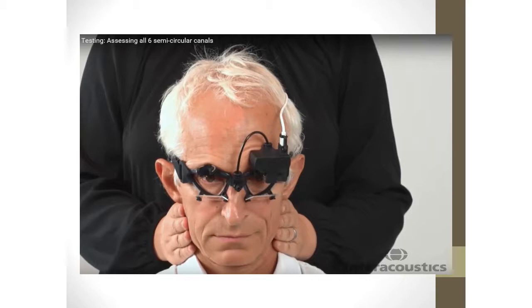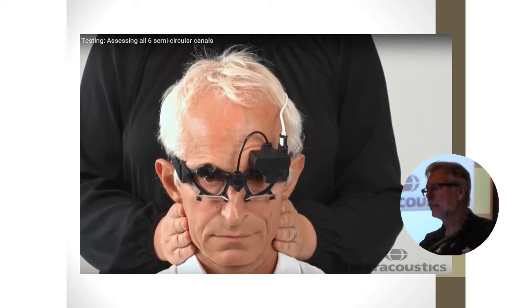And head movement is done by the clinician, not the patient. And it's done in both the horizontal plane and the vertical plane.